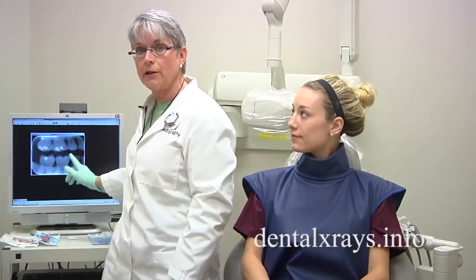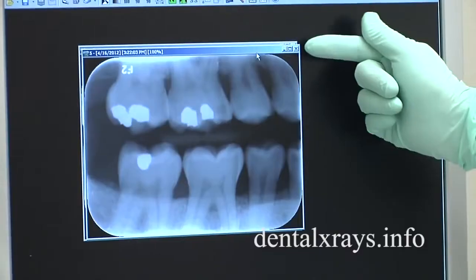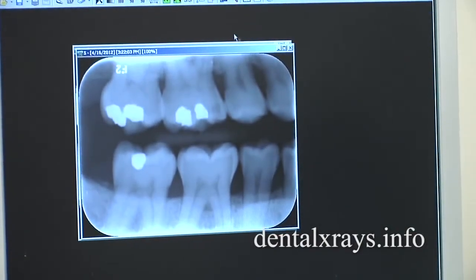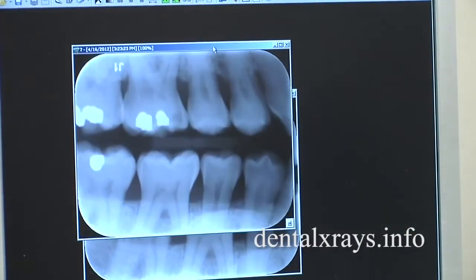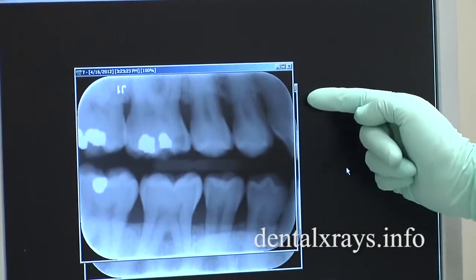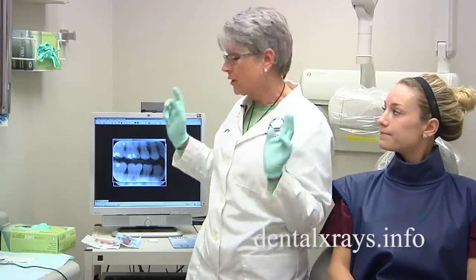When you first take it and you don't do the cross arch, this is often what you'll get — you don't get even the mesial of the first premolar or the distal of the canine. However, when you do the cross arch, you see that you can include the distal of the canine.